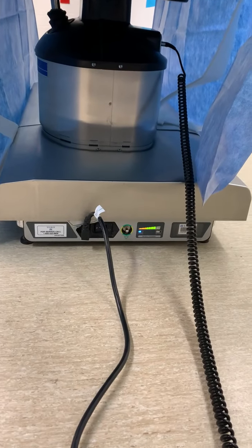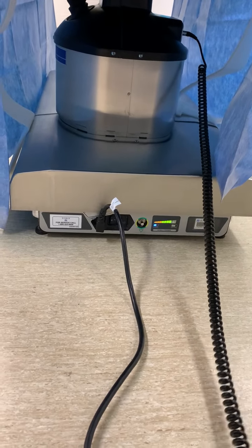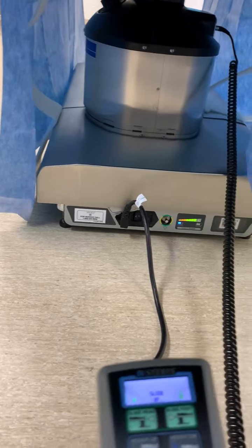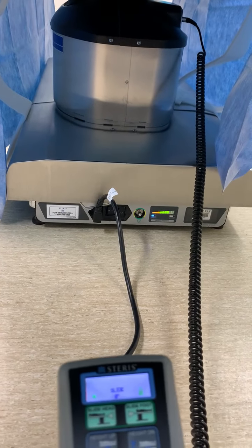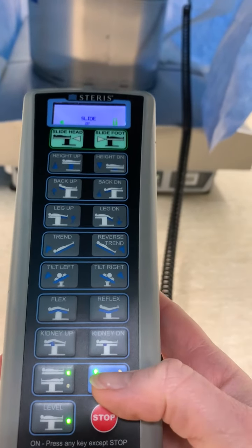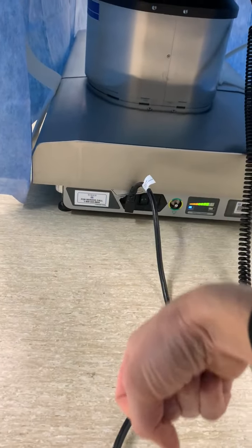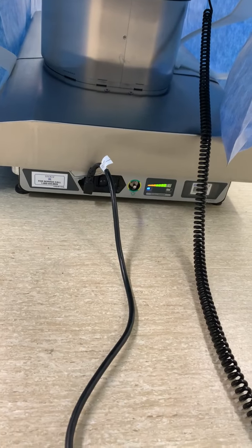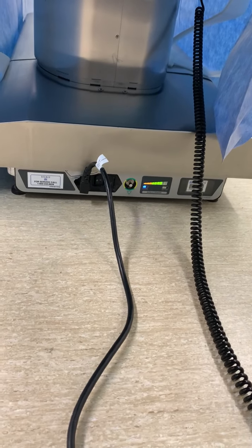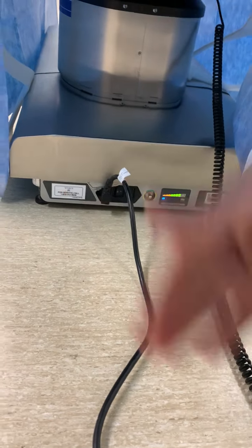So this again is at the head of the bed. Another thing: if you're going to move this table out of the room with the anticipation of doing a c-section on the patient's delivery bed, press and hold this for three seconds to unlock it, then come up here and just pull that plug out. So you don't have to worry about going to the wall unplugging the right cord — just unplug it from the unit and roll your bed out of the room.